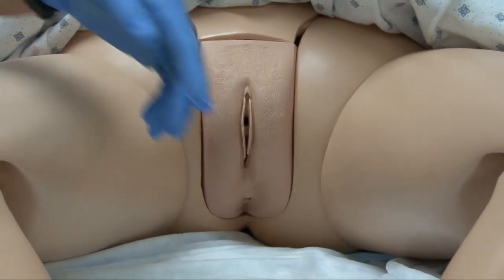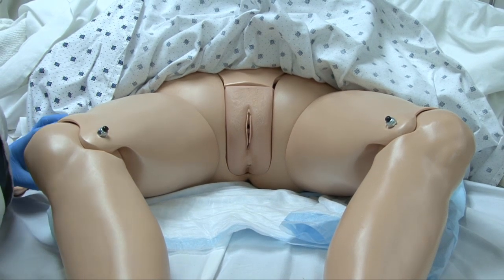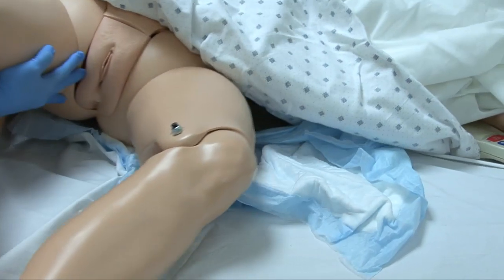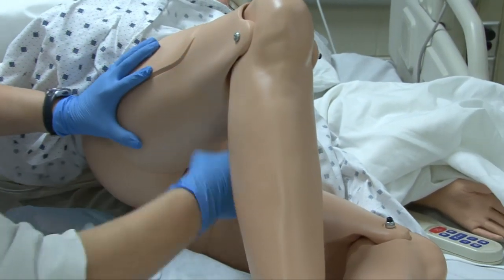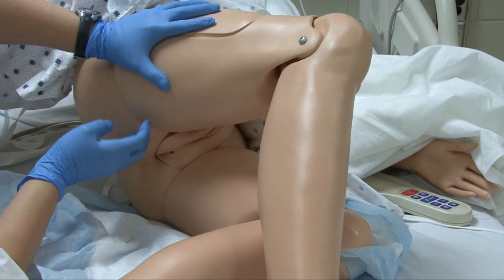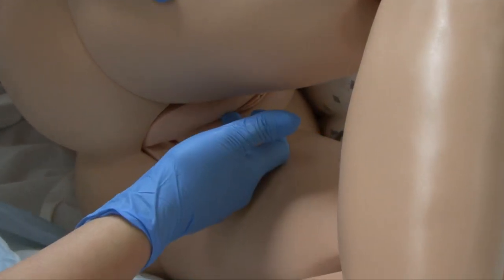I'm going to get her to move her legs to assess for mobility and any issues. If she had contractures, at this point I could actually turn her on her side — and I'm going to demonstrate that. As I turn her on her side, I would have to move her leg over and do this in a side-lying position. Your anatomy is the same: the clitoris, the urethra, and the vagina — I would use this hand to open it up. It's harder to do a side-lying catheterization, so you'll probably need some assistance if you have to do that due to contractures.